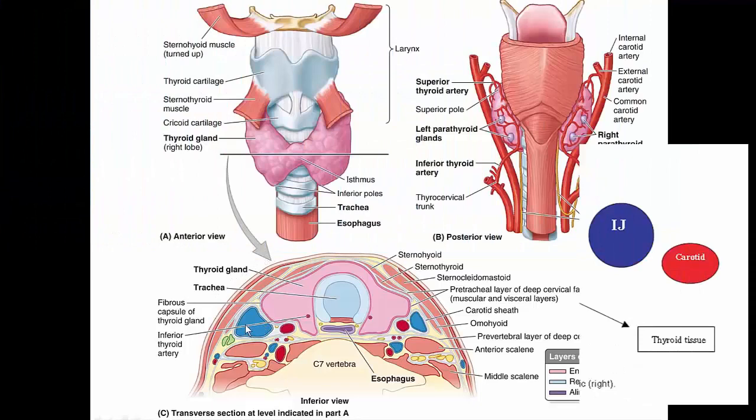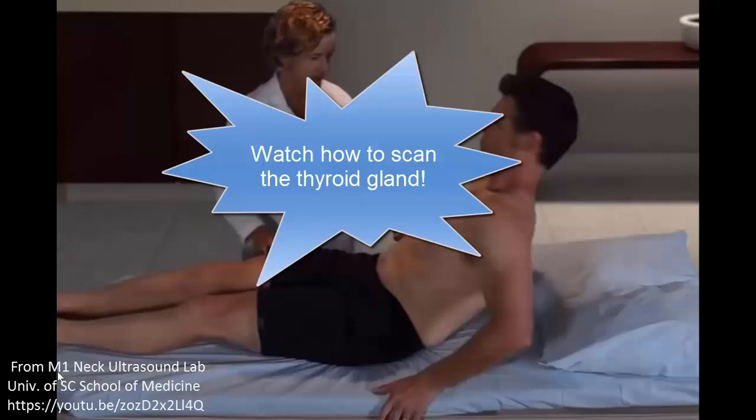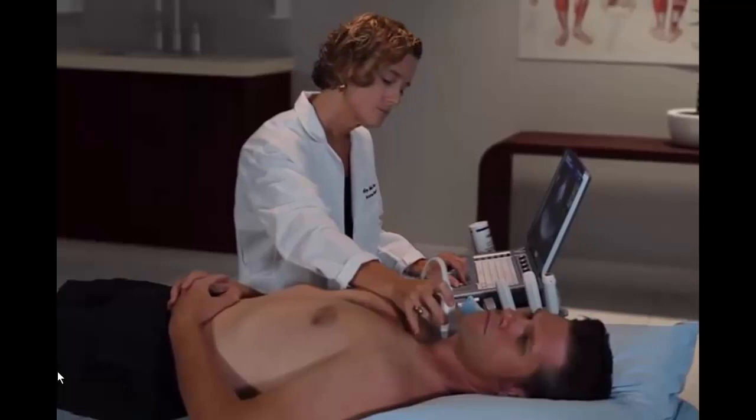If you move superiorly, you should see the bifurcation of the common carotid into the internal and external carotid arteries. Note that you can also do a Valsalva maneuver and have the IJV billow up nicely, and if you press down, it should be compressible. The patient should be lying supine on the examination table, raised to a comfortable level if needed. A pillow can be placed under the shoulder to provide better access to the thyroid gland by extending the neck.